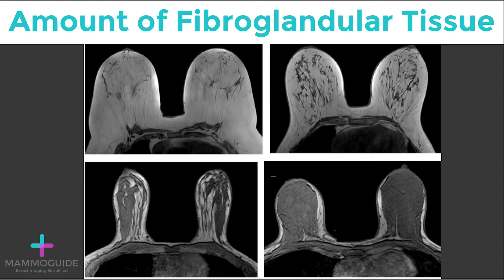Evaluating for the amount of fibroglandular tissue, you can see the first image in the upper left has almost entirely fat. The next image shows scattered fibroglandular elements. The bottom left is heterogeneously dense. And the bottom right is extremely dense fibroglandular tissue.